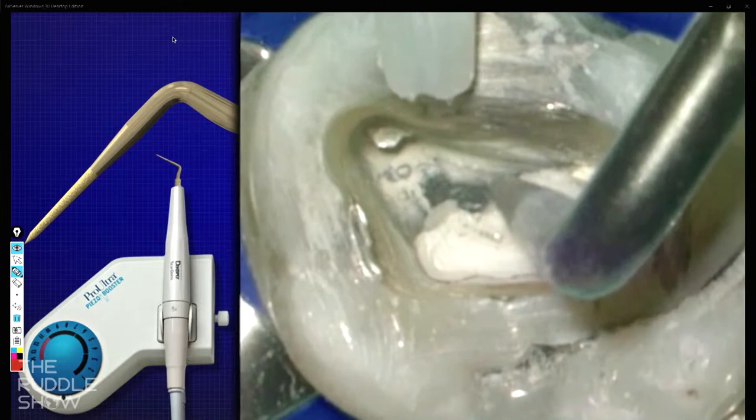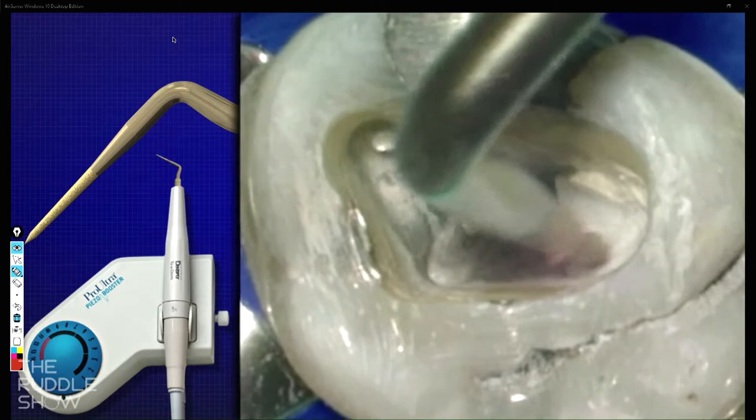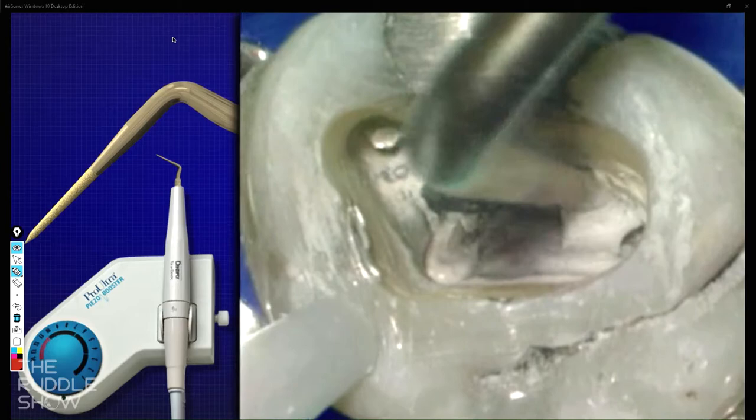Always chip out on that leading edge. If you're breaking up a slab of concrete and you're in construction, running a jackhammer, you don't start in the middle of the slab. You get out on the leading edge and that vibratory sinusoidal wave will split, break up, and disintegrate even the hardest of cores.